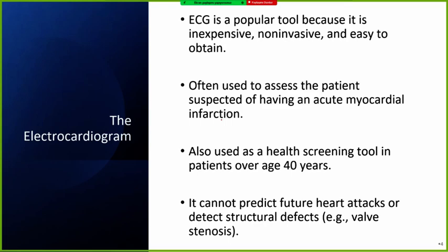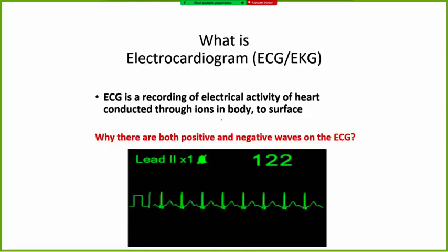However, it cannot predict future heart attacks or detect structural defects, because the electrocardiogram is the recording of electrical activity of the heart conducted through the ions in our body.